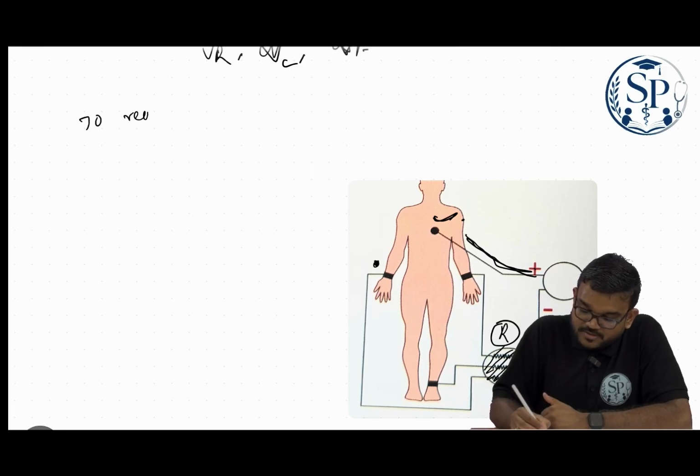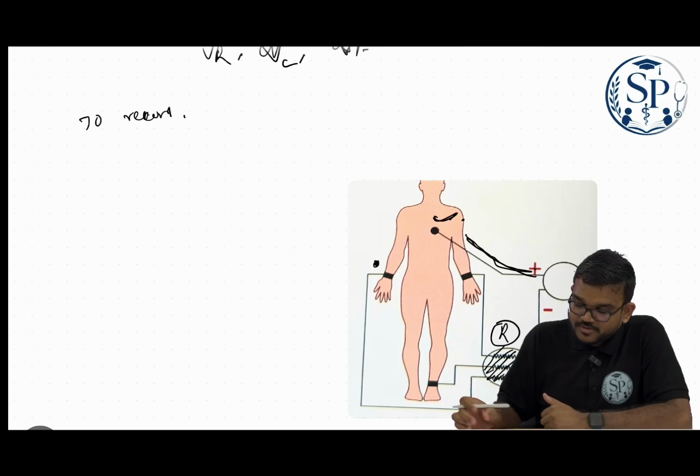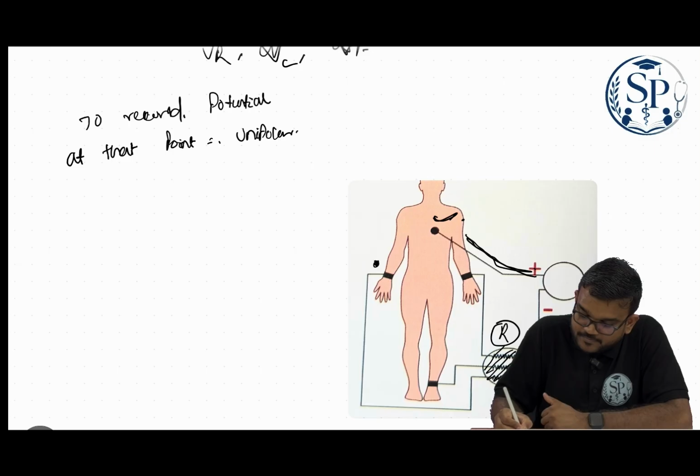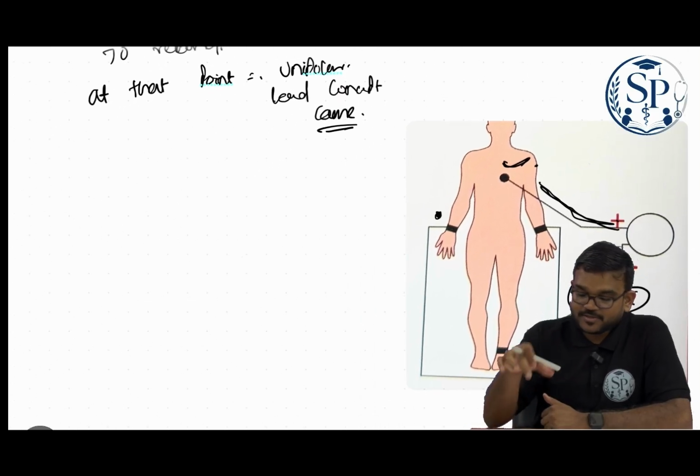So to record the potential at that point only, the unipolar lead concept came.